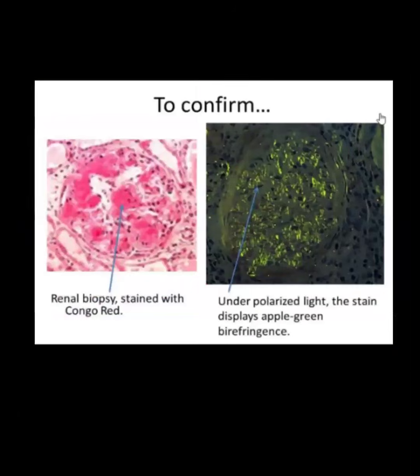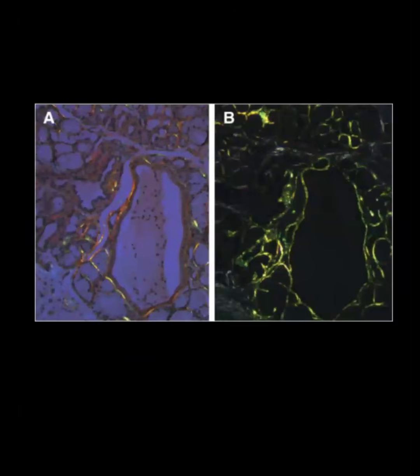This is a slide that is usually asked in case of amyloidosis in an old age patient, which can be AL amyloidosis or AA amyloidosis. It is actually a Congo red stain. Congo red appears as apple green birefringence under polarized light. If you use polarized light, you can see the apple green birefringence. Next is the slide of Congo red. Here it is again Congo red.